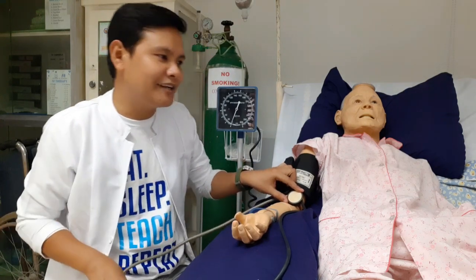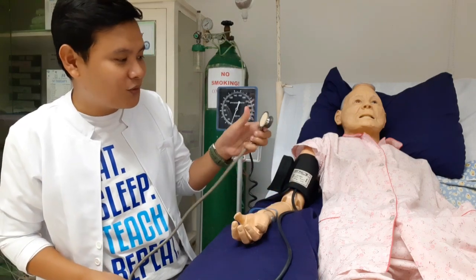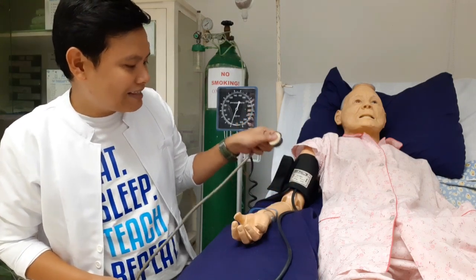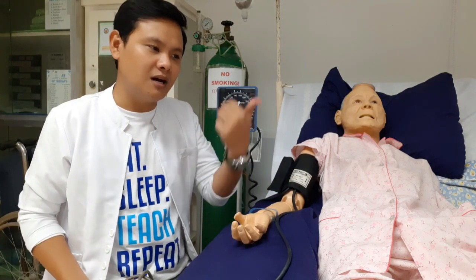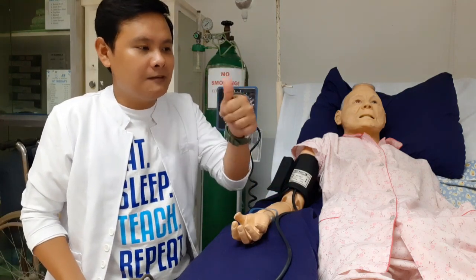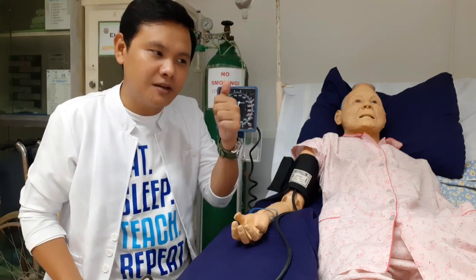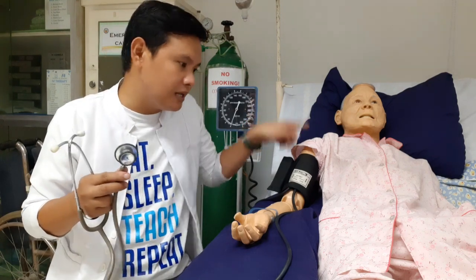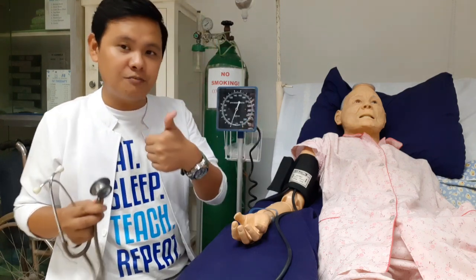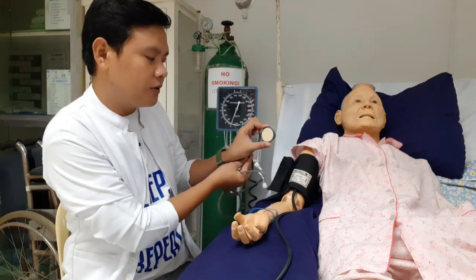Some other students, I see, hold it like this, with the thumb placed on the diaphragm. That is how they hold it. Don't do that. Why? As I have told you before, the thumb also has a pulse. So you might feel your own pulse, and instead of hearing the patient's pulse, what you hear is your own pulse. So better, let's not do that. This is how to hold it.